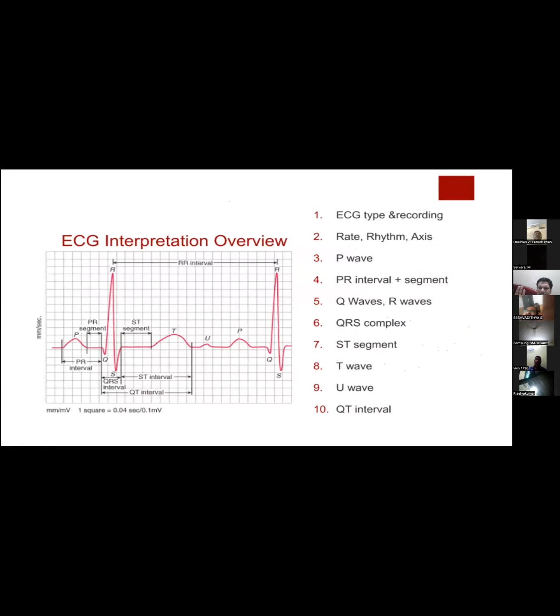So this is all very basic, which I want you to understand. But over a period of time, whenever the topic comes in class, this will be made easier for you to understand. So how do you want to interpret the whole ECG? That is simple. Whenever you are seeing an ECG, in the last 15 days or so, I always see people jumping to the diagnosis. Please do not jump to the diagnosis. That is not going to help us in fine-tuning our ECG knowledge or getting the complete diagnosis, because the obvious is obvious, but the inobvious is what matters. For example, ST elevation might be obvious, but we might be missing a complete heart block in inferior wall MI.